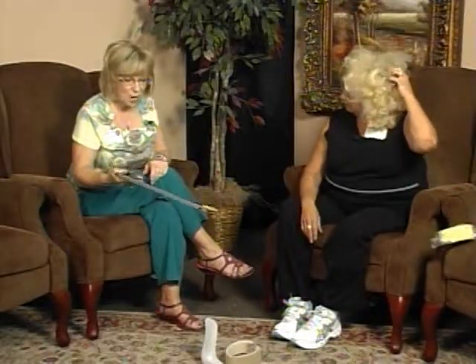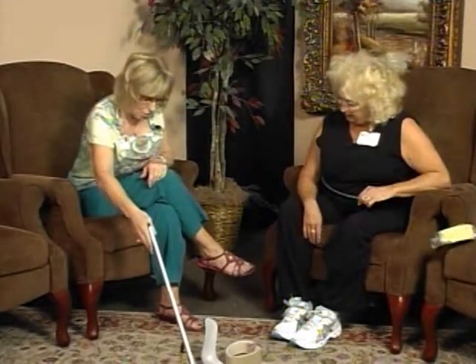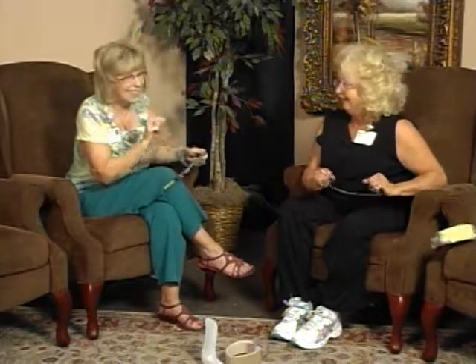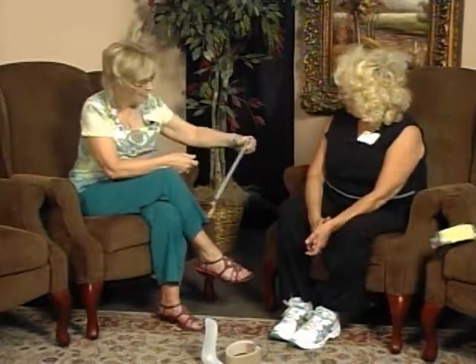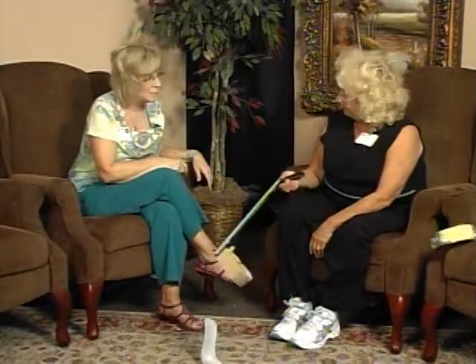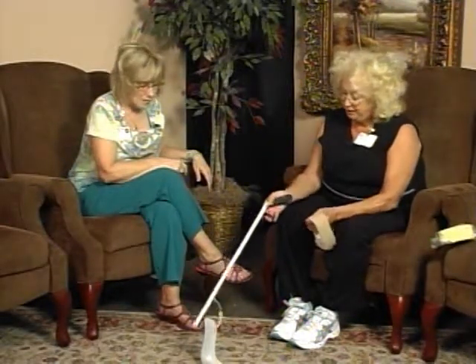But you were talking about this, that you'd gotten one of these for your mom, so that she doesn't have to bend over to get things. And although my husband is not as old as my mother, he's only like 62, when he plays with Elvis, the dog, he uses this to pick up things. You can pick up something very light, and you can pick up something a little heavier, like this.